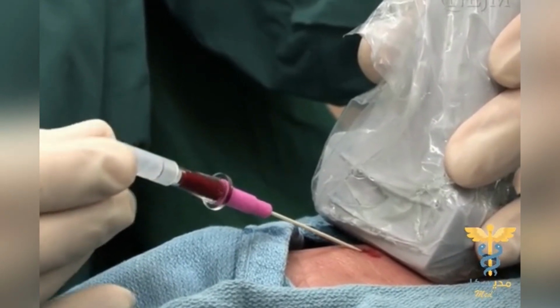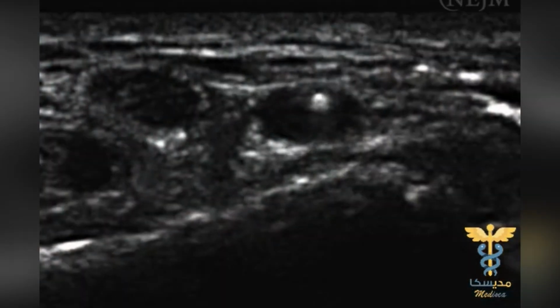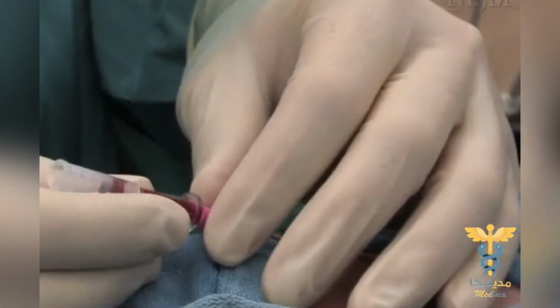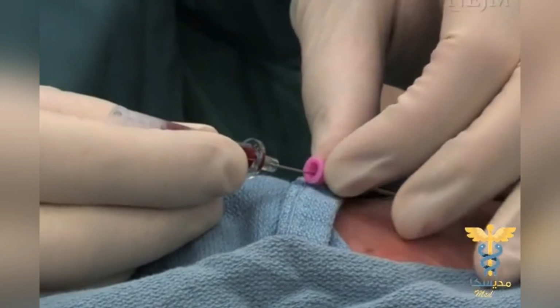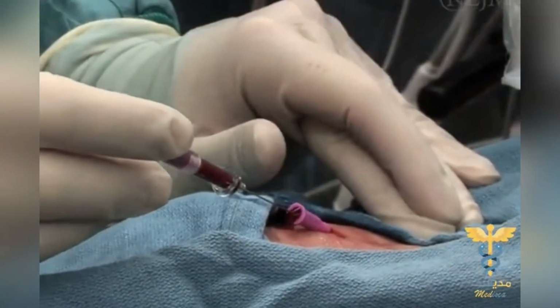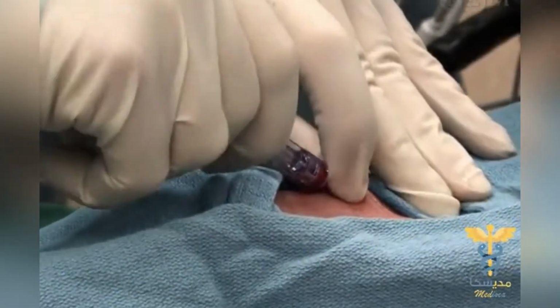Flatten the angle of the angiocatheter and then re-examine the area on the ultrasound monitor to make sure that the needle tip is still in the artery. Slide the catheter over the needle into the arterial lumen. Apply pressure proximal to the catheter, remove the needle, and attach the catheter to the transducer.